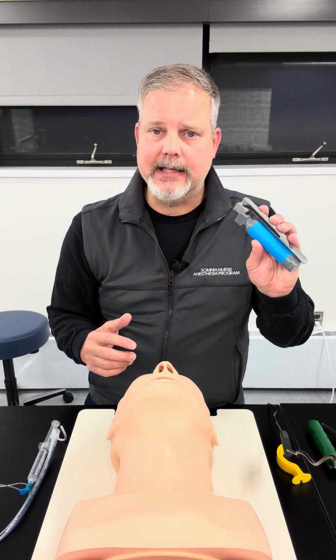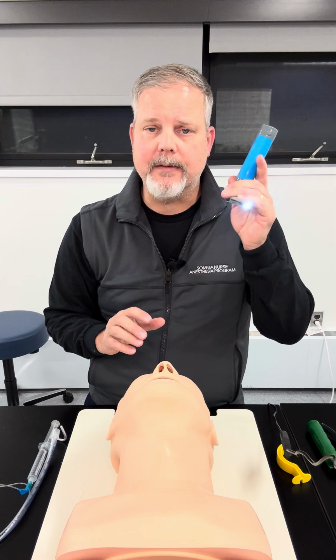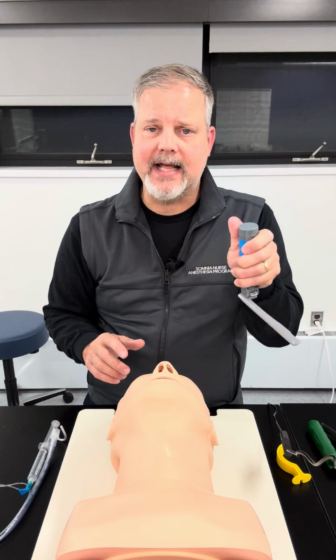So the next thing we're going to do is pick up our blade and open it up to make sure that we've got our blade in the optimal position and that its light is working, and we hold our blade in our left hand.